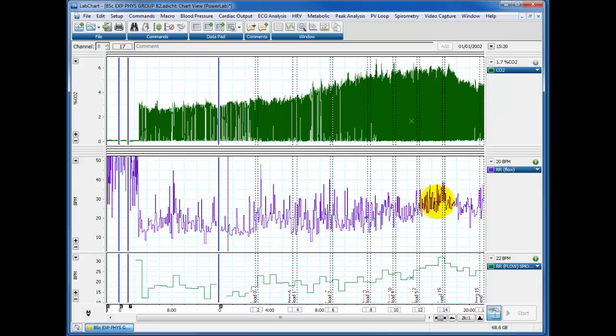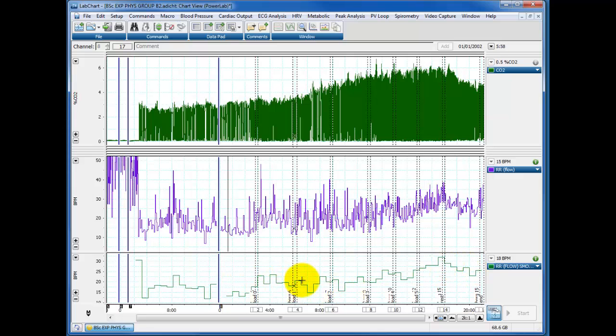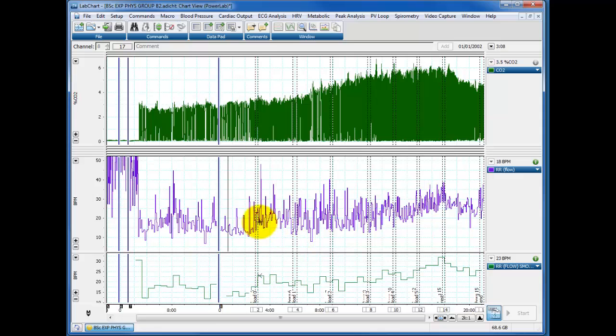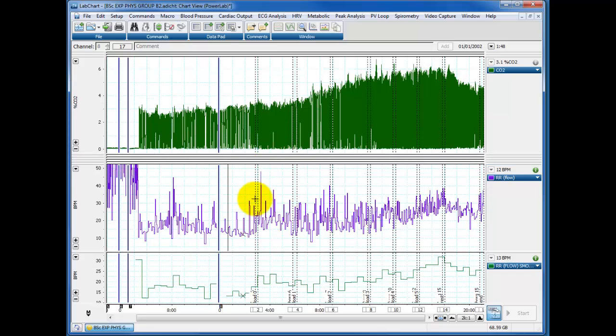So certainly use these data here for your analyses. I encourage using a smoothing like this, a quick look-see, just to see where trends are and see what kind of data you expect to see. But certainly take your binning data, your averages, from the raw trace here so you can if you need to exclude any strange anomalies, where, for instance, respiratory rate goes from twenty to seventy in one breath. That's clearly a mistake.